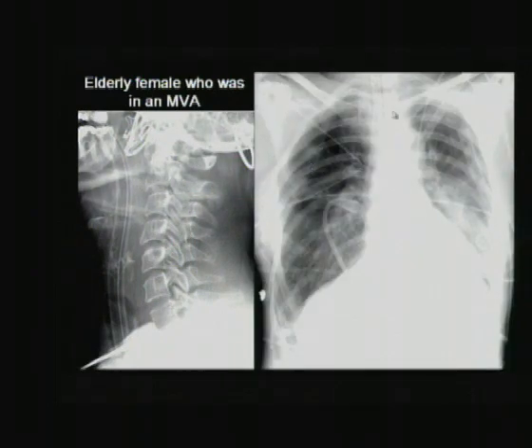This is another patient who came into the emergency room, deathly ill, actually, and the surgeons wanted to open her right away. The fellow was looking at this. He looked hard, and they were pushing him to come up with something, and he couldn't. I looked at it. I couldn't come up with much here. And you can see the chest. There is tension pneumothorax, multiple ribs, fluid in the chest. The mediastinum was wide. There's fluid up here. So we were really worried about a ruptured aorta here.